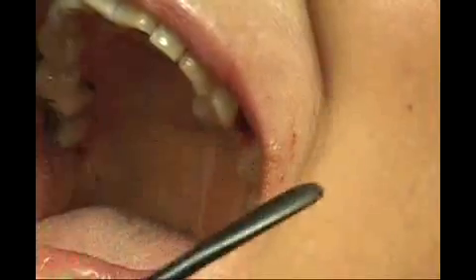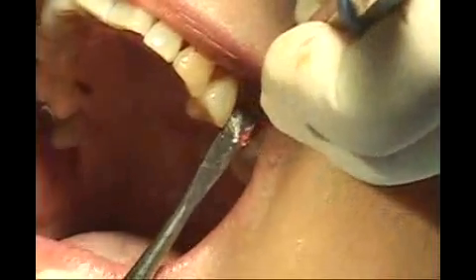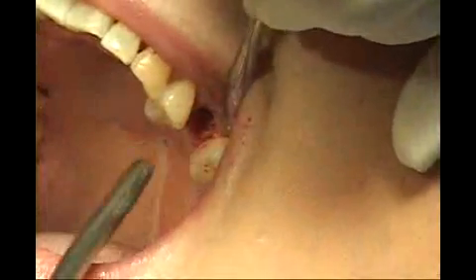So I usually just take a little bit of bone graft, and you can cover up the hole if you want first with a cover screw, but I usually just take it to the buccal and pack it. And then the excess we can suction up. And this will also suction up the excess that's in the access hole of the implant.